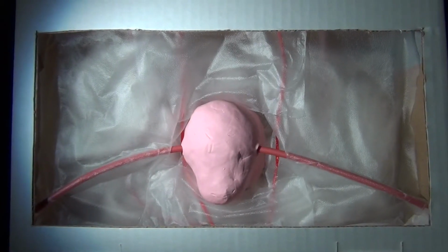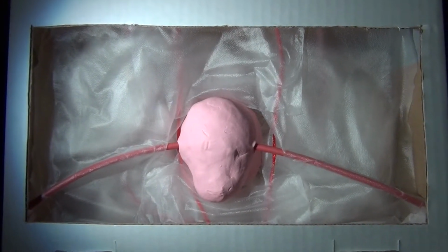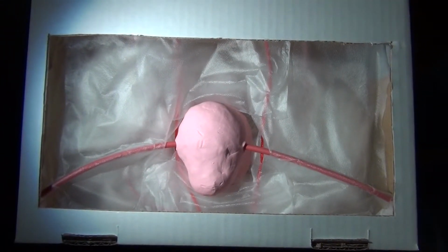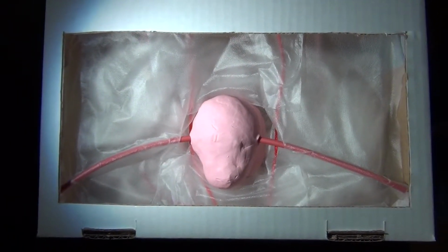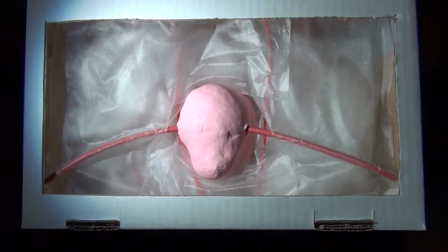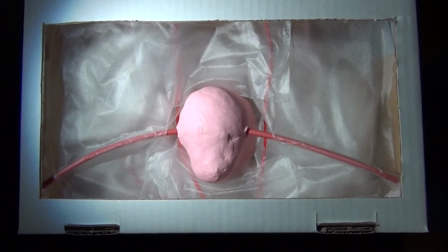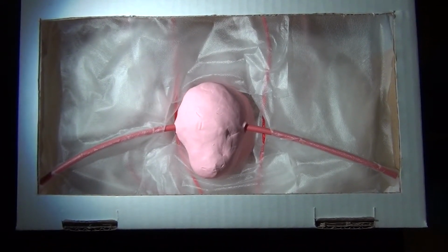Now I am going to demonstrate doing the simulation model of a retroperitoneal dissection. Hemostat. Note that it is important when you grasp the round ligament that you would ideally like to grasp it as distally as possible. This will allow you to enter into the lateral aspect of the retroperitoneal space in order to do your dissection and find the ureter and the infundibulopelvic ligament, which will typically be placed on the medial aspect of the posterior sheath of the broad ligament.